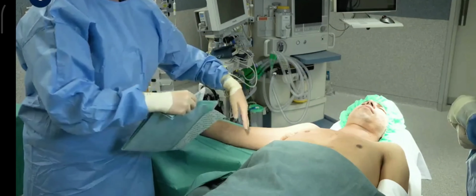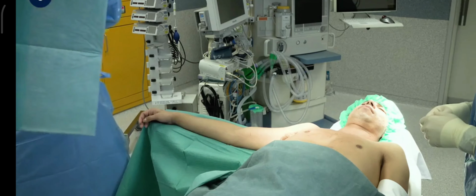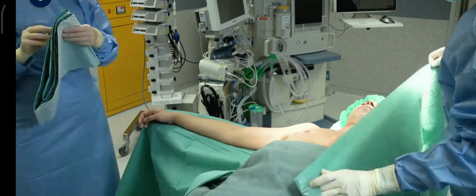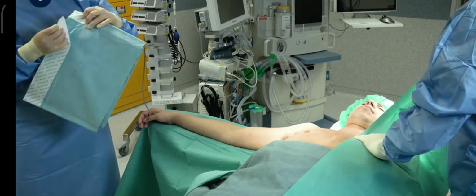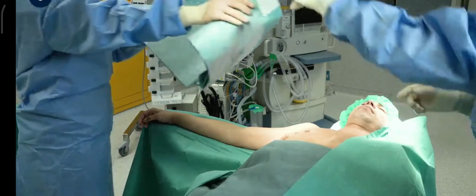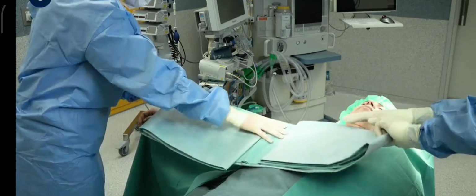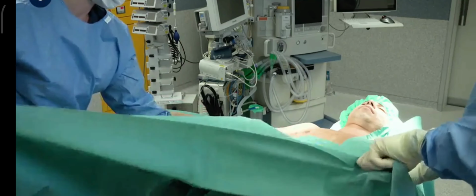In this film, the same assistant then scrubs in to assist with draping the chest and arm. A third person may also do so. To drape in this manner, a version of the square configuration is used. A smaller drape is positioned on one side of the surgical site. With this smaller drape in place, a larger drape is positioned at the caudal end of the surgical site.